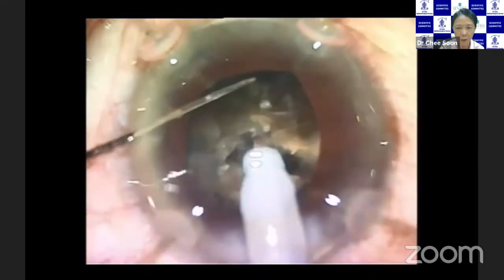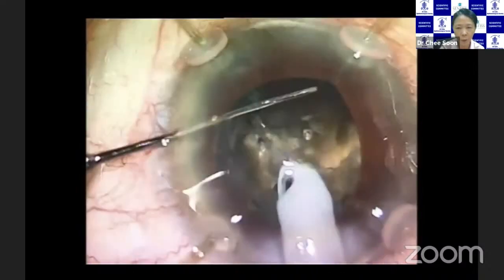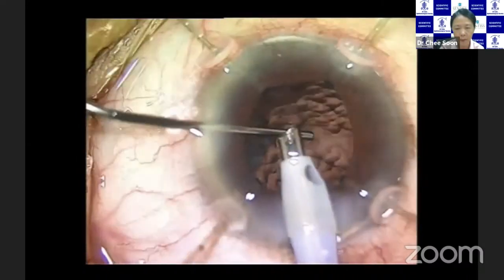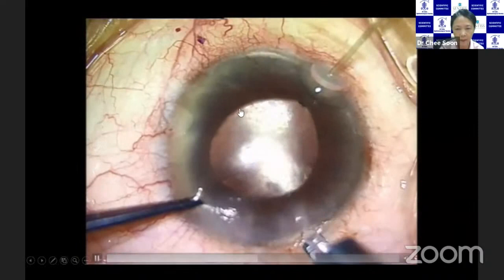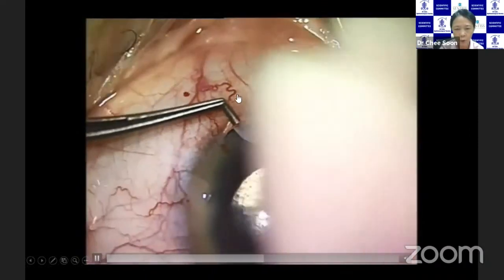And a very short vertical trench. I impale. I like to do horizontal chop. Right? It can be a bit tricky if you don't know where the equator was. And that was the reason why at the start of this case, I used the Coughlin hook to look at the equator. And at the end of that, before you come out, it's important to maintain the anterior chamber and then insert the IOL. And you will see that I had no cortex that was trapped.